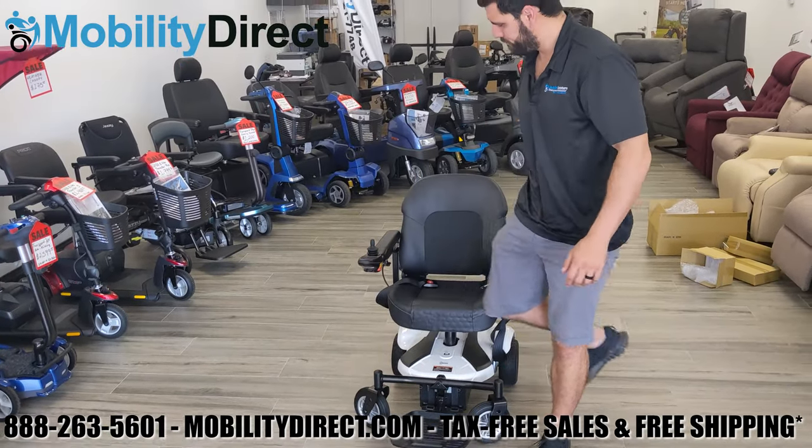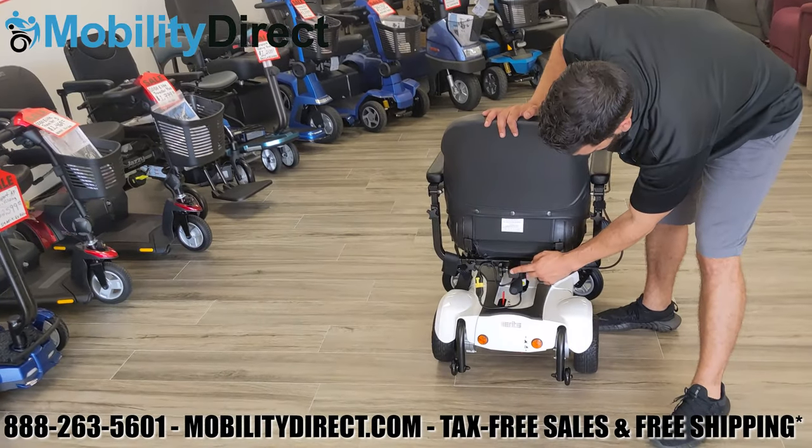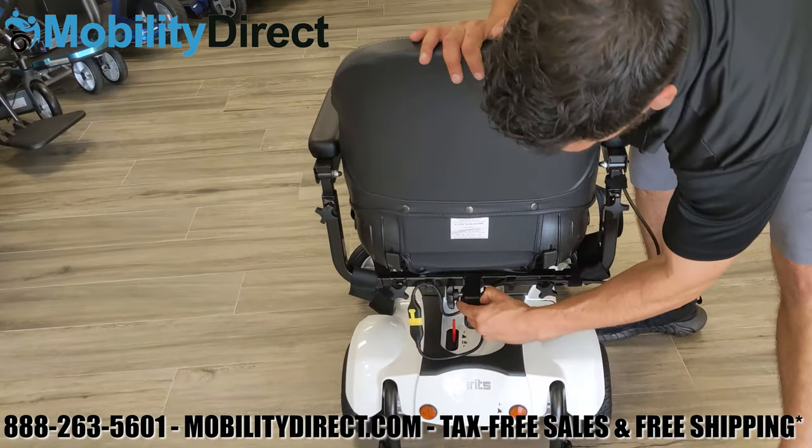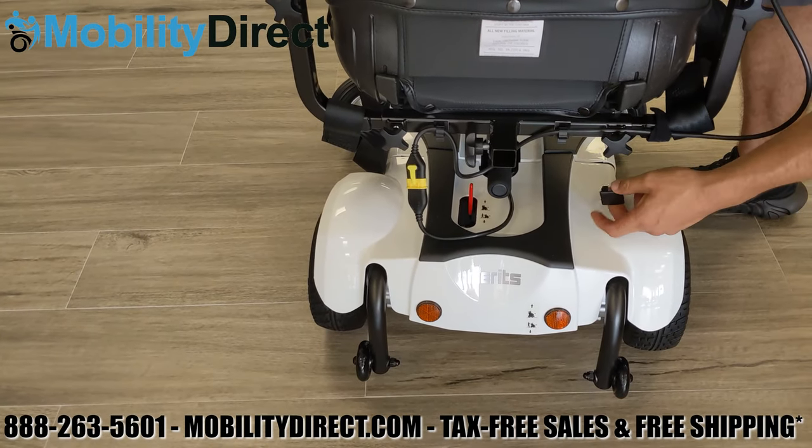It has a top speed of four miles per hour. The footplate does flip up and out of the way, and in the rear there is a universal one-inch accessory port which you can use for oxygen tanks, baskets, and many other accessories.